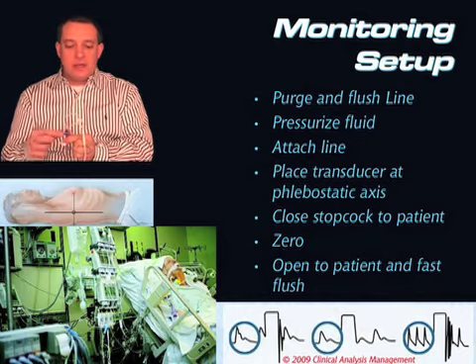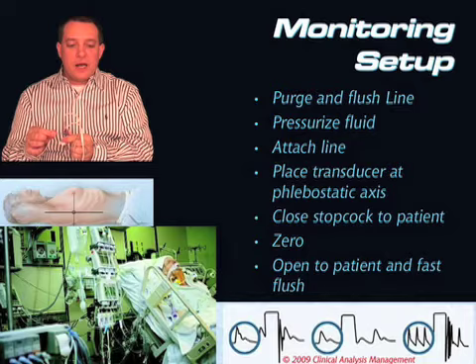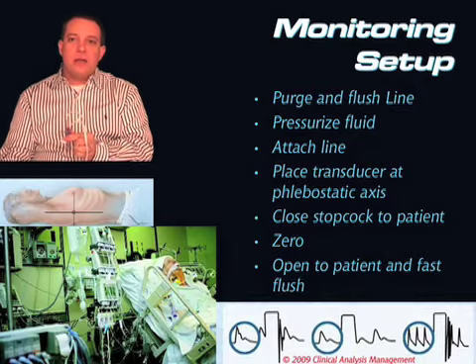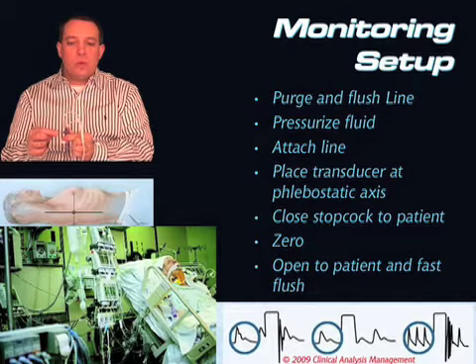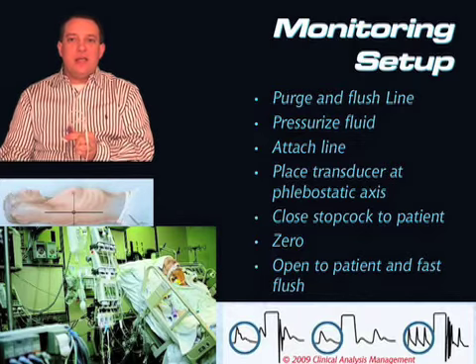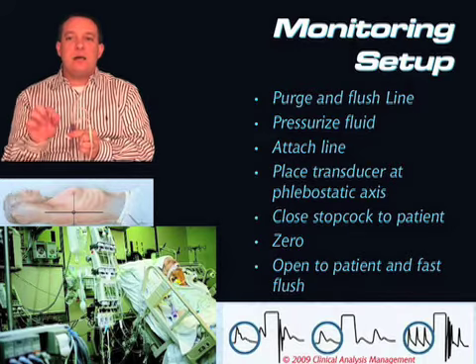As soon as I release it, obviously the system should stop. As long as fluid is being shot out at 300 millimeters of mercury, that means there's 300 millimeters of pressure in that blood vessel, so there should be a plateau in the waveform along the top. What we care about is what happens when we release the pigtail. When I release it, I should see the pressure immediately drop down, but there should be some recoil there.